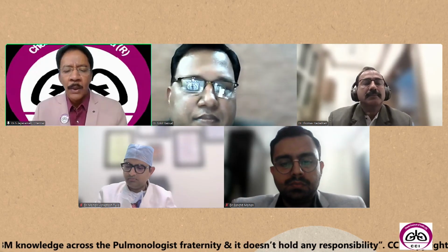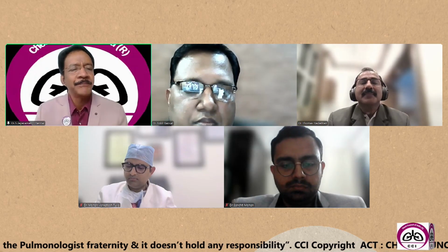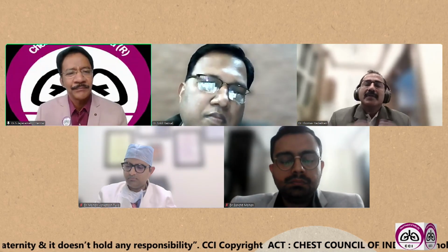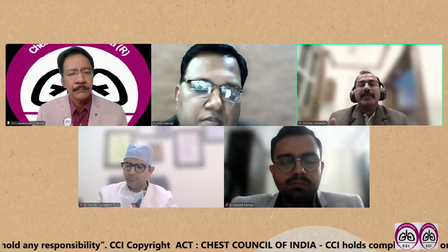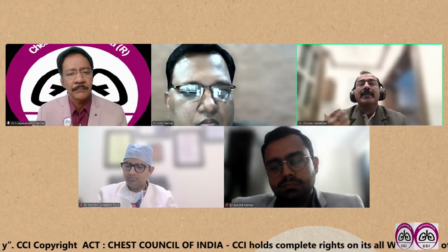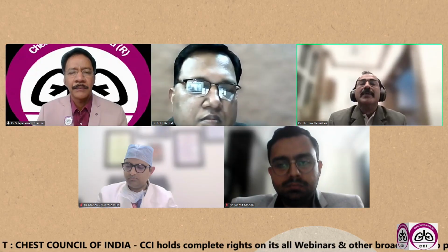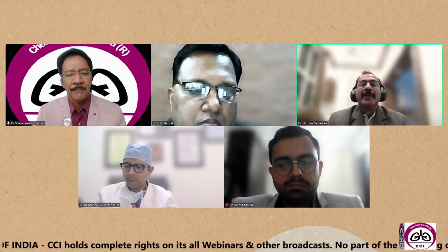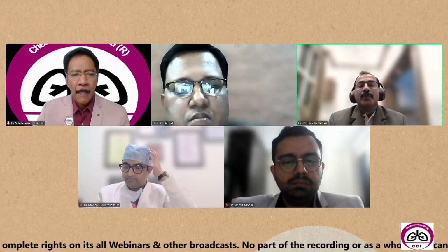What are the extranodal indications and applications of endobronchial ultrasound bronchoscopy? Yes, so far in the discussion, we are saying that the vascular structures are roadmaps to our destination, that is the lymph node. Why don't you study the roads like the SVC? There may be a tumor thrombus in the SVC, or maybe a real thrombus in the SVC, which you can definitely visualize by using the probe with your EBUS scope. And that's an indication for stenting prior to radiotherapy or whatever. It will be helpful for your oncology colleagues.